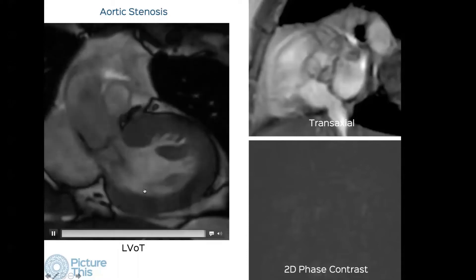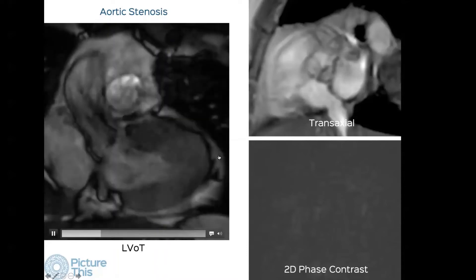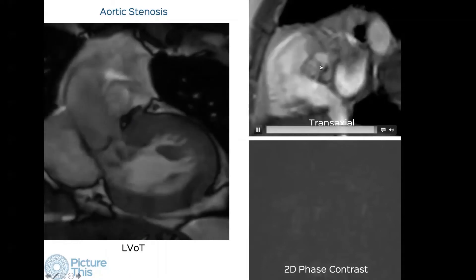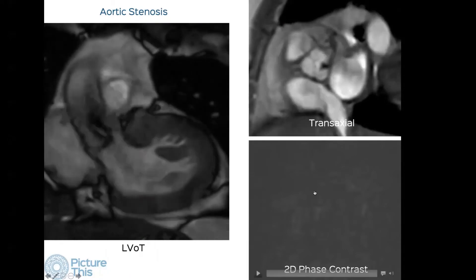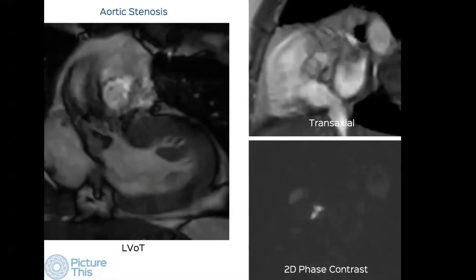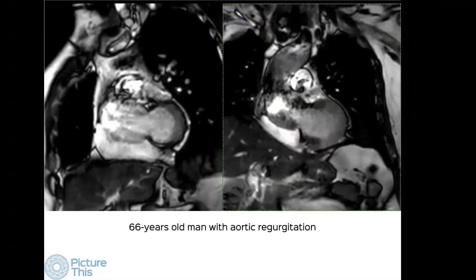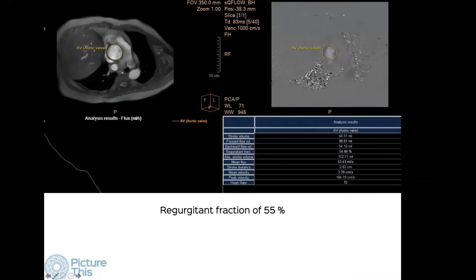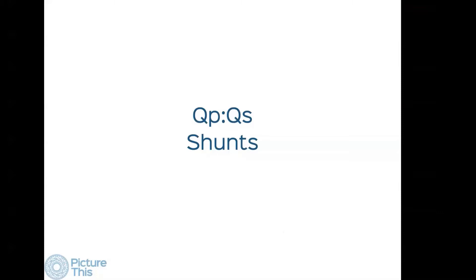We have special sequences — a transaxial view showing how much the aortic valve is opening, and a specific sequence to measure velocity. Here is a 66-year-old man with aortic regurgitation; this is the LVOT view with the regurgitant jet visible. We can measure the peak velocity, which is 1.8 meters per second, and calculate the gradient using Bernoulli's equation. Here we measured the regurgitation fraction, which is 55 percent.